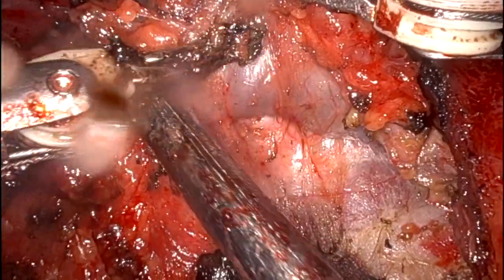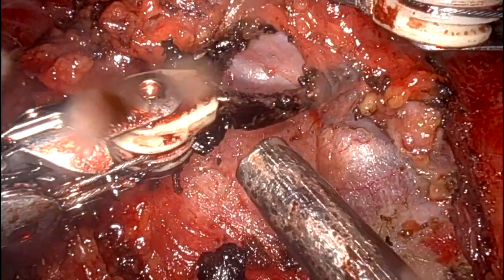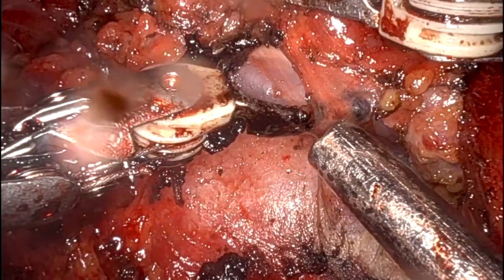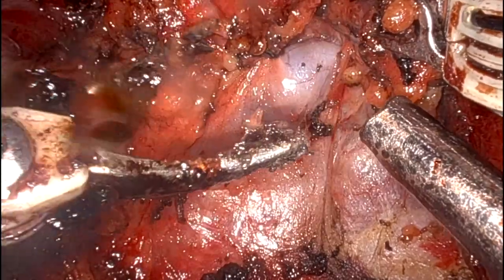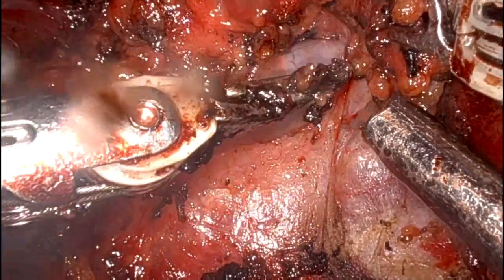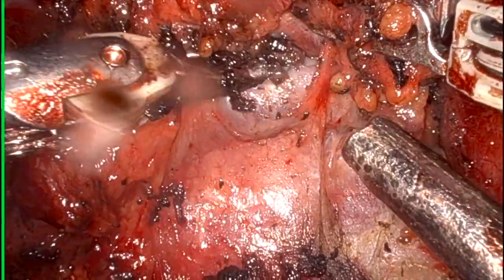I am working on internal jugular vein right now. Can you see how we can dissect with Maryland forceps? You can open up the plane and then easily cut.